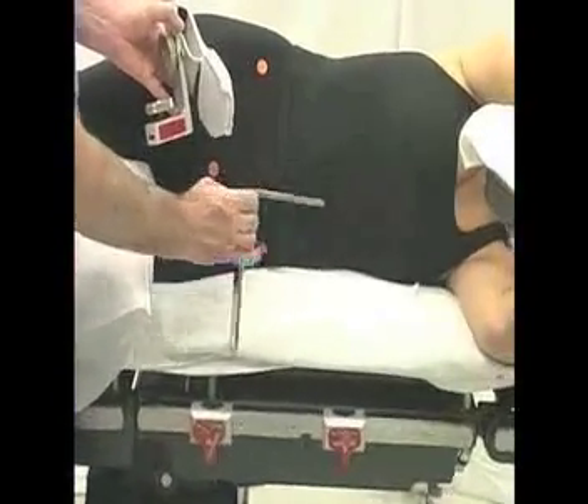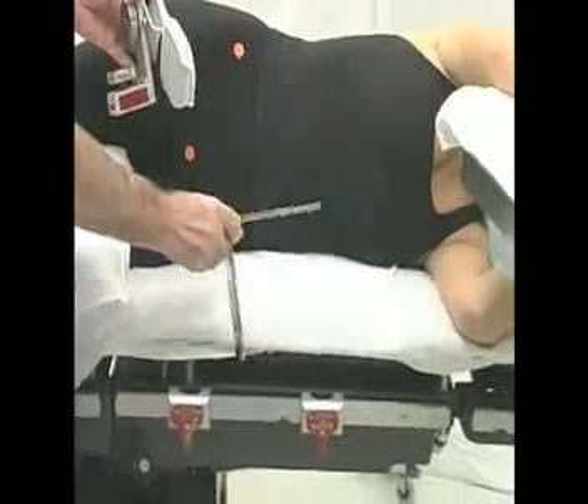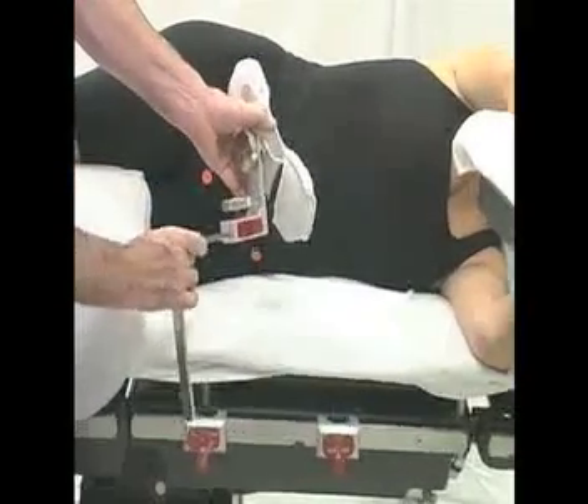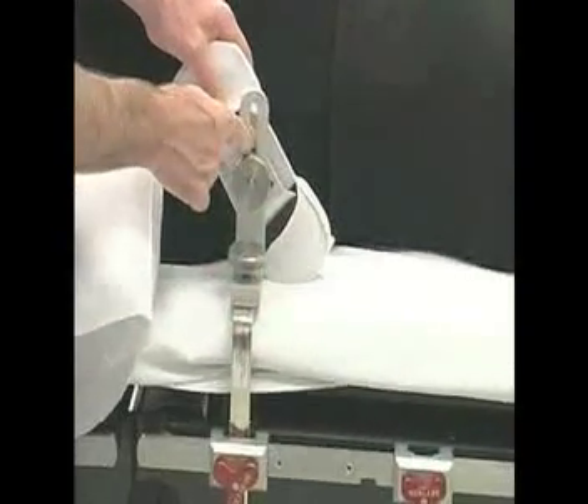This is a distinct advantage of the Hip Grip system compared to systems that place the patient over the middle of the table. Also note that the Hip Grip system has a low profile and avoids placing bars or knobs in the surgeon's groin.